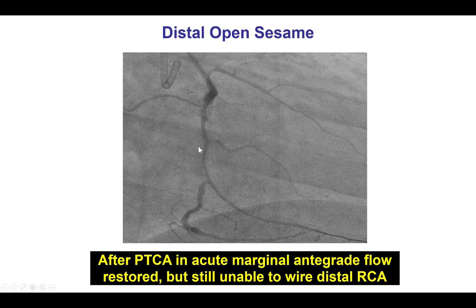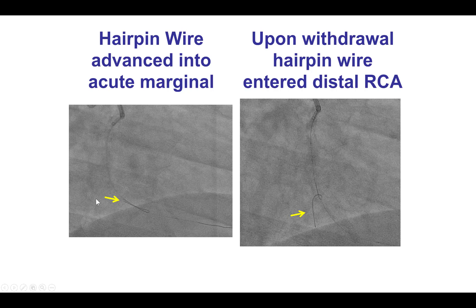Here is an example. This was a CTO of the mid-right coronary artery in which the wire crossed into a large acute marginal branch, but we were unable to advance it into the distal right coronary artery. To solve the problem, we advanced the knuckle all the way into the marginal branch, and then coming back, the wire unraveled and entered into the distal right coronary artery.